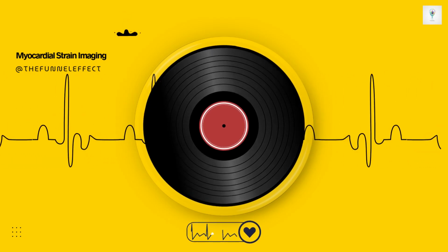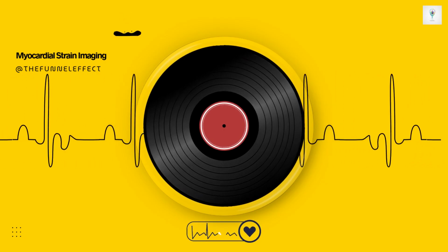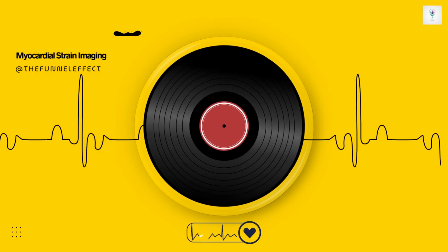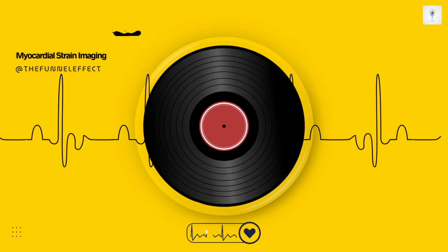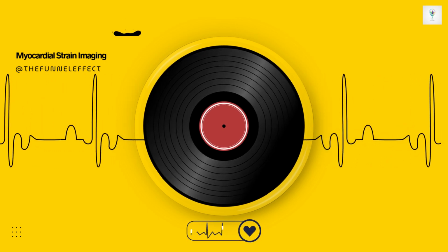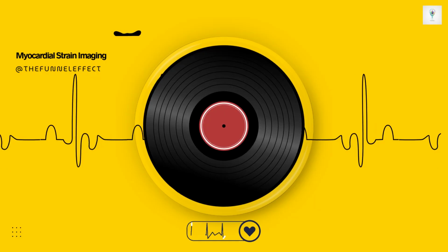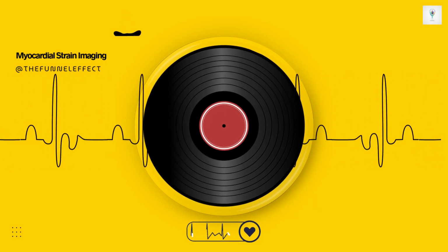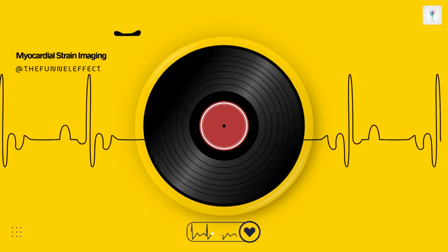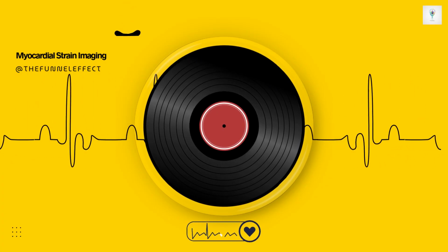How sensitive? The review cites a fascinating study. They looked at the effect of mental stress, just having people do stressful mental arithmetic. This caused only a moderate increase in systolic blood pressure, a relatively small increase in afterload. And it significantly reduced GLS, not just in chemotherapy patients being monitored, but also in healthy controls. Wow. So just being stressed during the scan can lower your GLS reading. That's basically a white coat effect for strain? Absolutely. It's a perfect example.